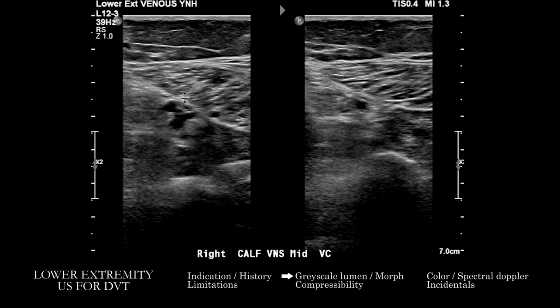You see here various vascular channels, and all but one, the artery, compresses well, here without compression and then with compression. But sometimes you'll have to rely on color Doppler here. And if you're only ever seeing vessels being patent and compressing well only on color Doppler, you have to include that caveat. You have to remember that you cannot exclude non-occlusive thrombus.